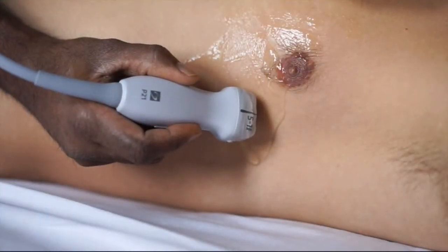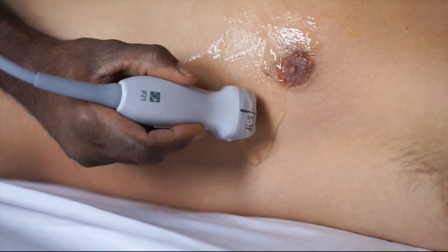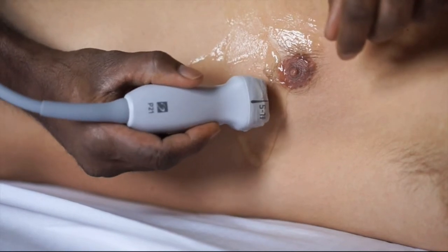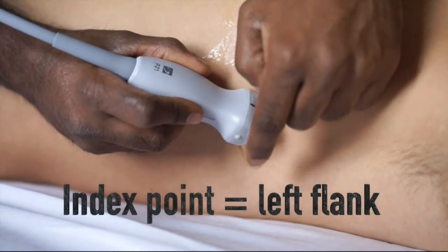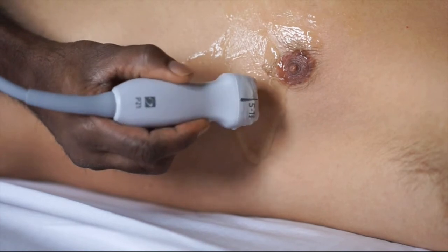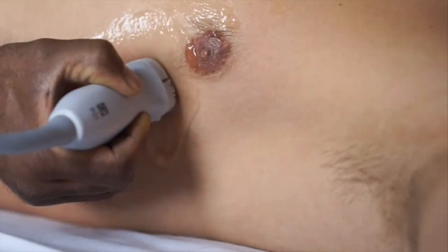Now the anatomical surface landmark for the apical 4-chamber view is the same as palpating for the apex beat. The index point of the probe should face towards the patient's left flank. Now as the patient is in left lateral position, one may have to move the probe more laterally sometimes to get the best view.